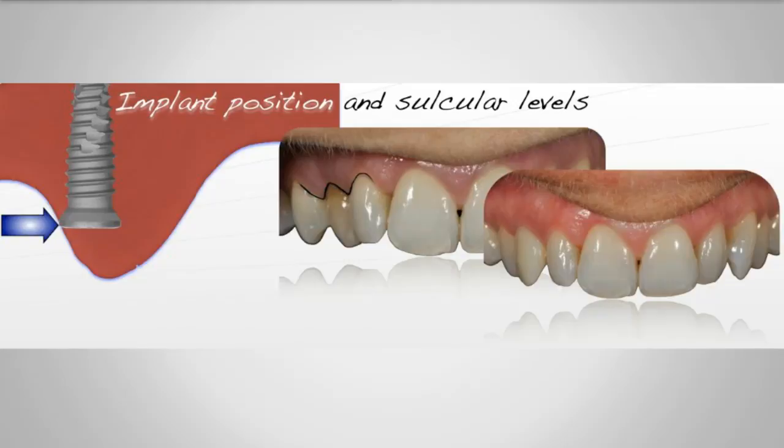What type of implant was placed flapless was the question that was asked. In both of these examples, these were Biomet 3i implants. I do work for Biomet. I'm not right now, but these both happen to be Biomet. The first one was a certain Prevail. This one happens to be a certain tapered implant. It's not a Prevail type implant. We're not going to platform switch on this one.